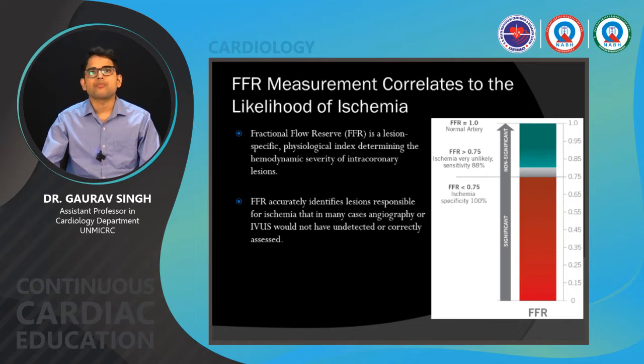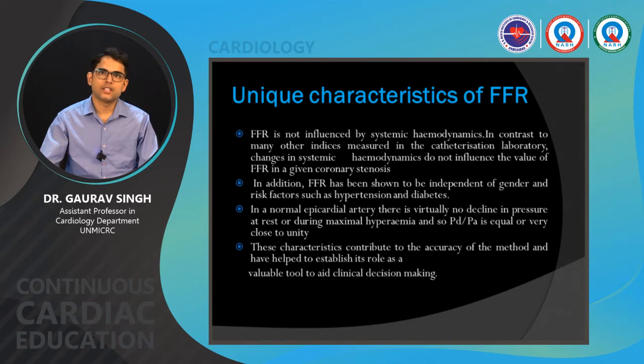So what are the unique characteristics of FFR? FFR is not influenced by systemic hemodynamics, in contrast to many other indices measured in the cath lab, which change with systemic hemodynamics. These do not influence the value of FFR in a given coronary stenosis. In addition, FFR has been shown to be independent of gender, and risk factors such as hypertension and diabetes. This is a very important point. FFR is not influenced by gender, race, or other risk factors like hypertension and diabetes.